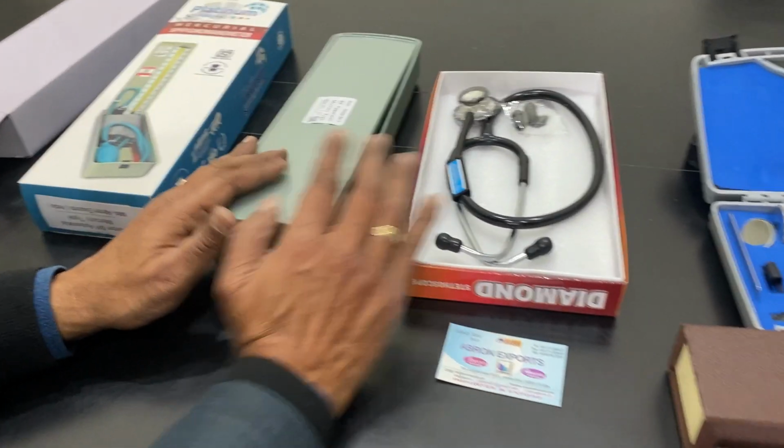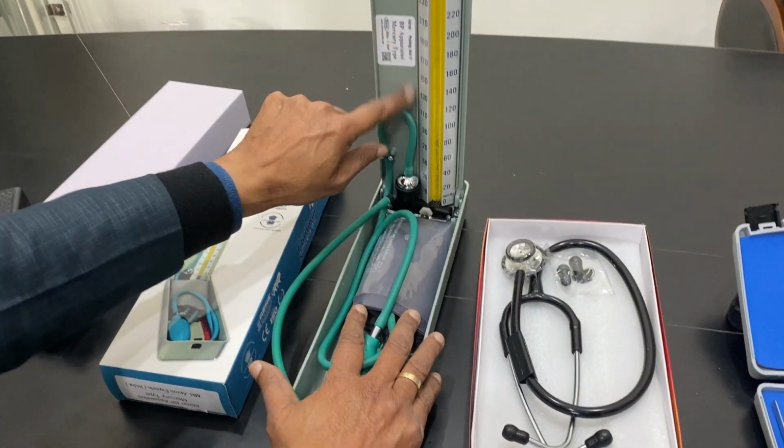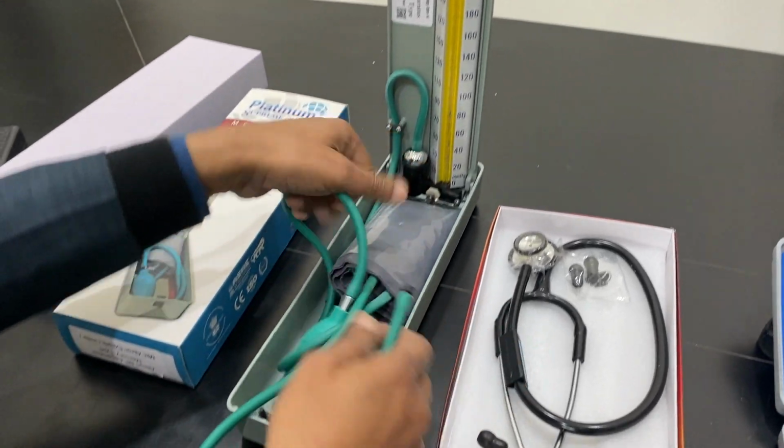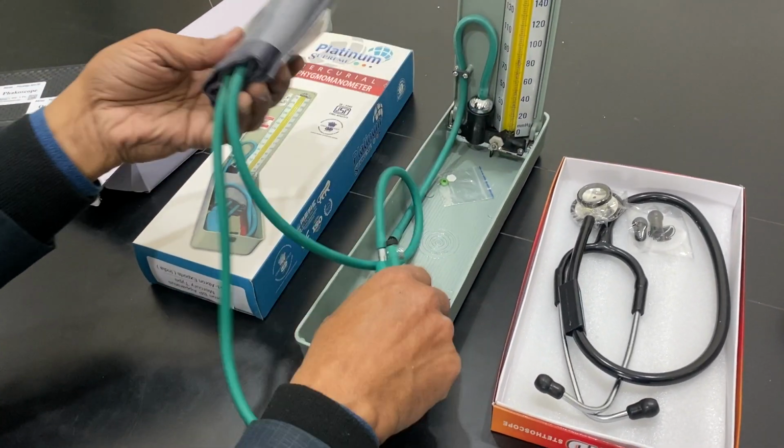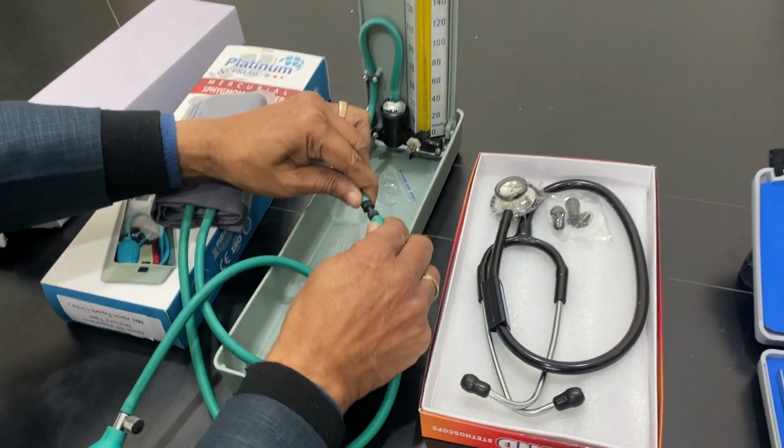This is a BP apparatus and stethoscope. We have got the BP apparatus, which is mercury based. We have got the digital also. It comes with a cuff arm and air bellow, lockable air, and then you can connect these two.